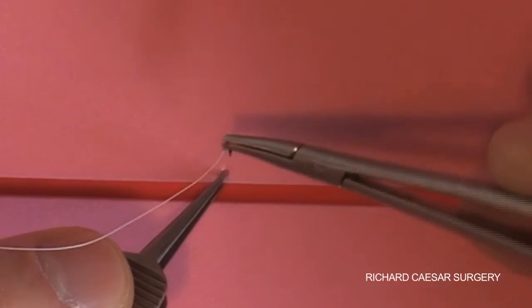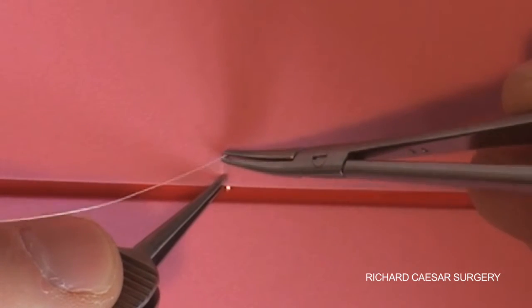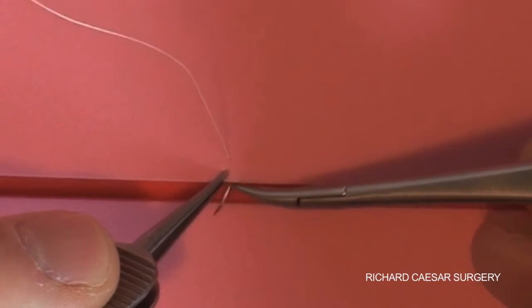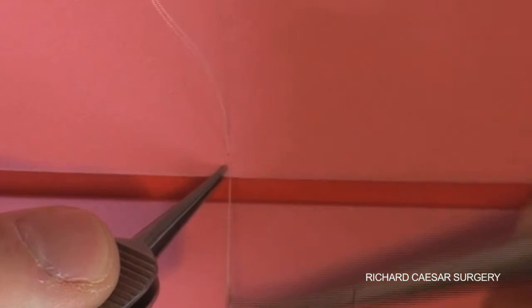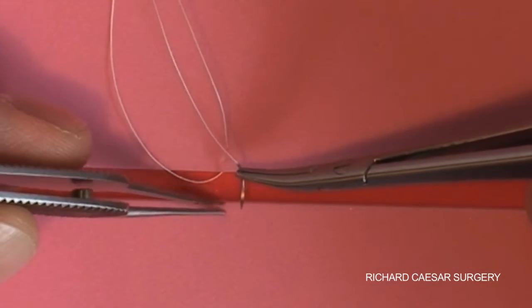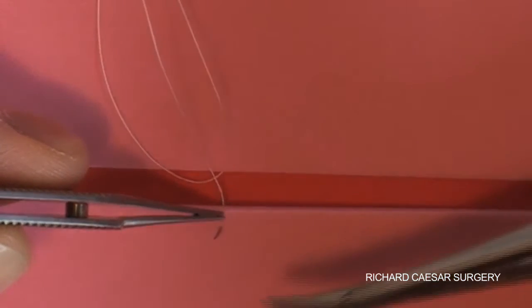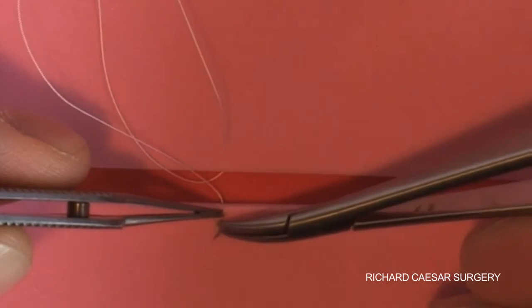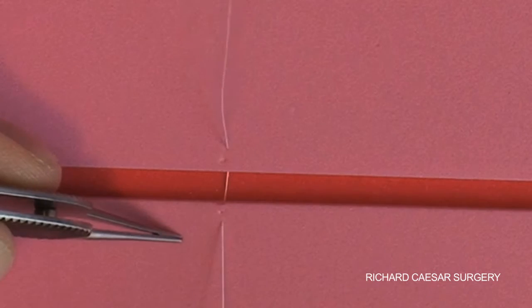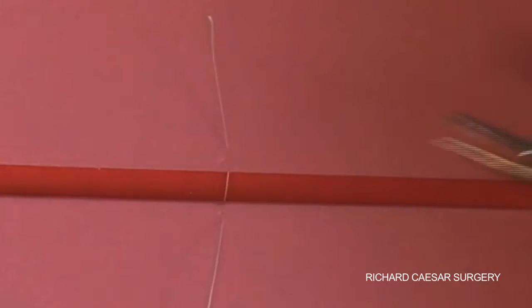Hold one skin edge, angle the suture, and pass it through the skin. Push it through, pick it up again on the other side with a couple of little shuffles, and you're ready to reuse it without having to re-sight it. Pick up the opposite skin edge with a roll of your hand, pass the needle through the skin edge, another little push, and then pull it through again with a little shuffle out on the other side, having rolled your knuckle in a clockwise fashion such that the needle holder can pull the suture back out.